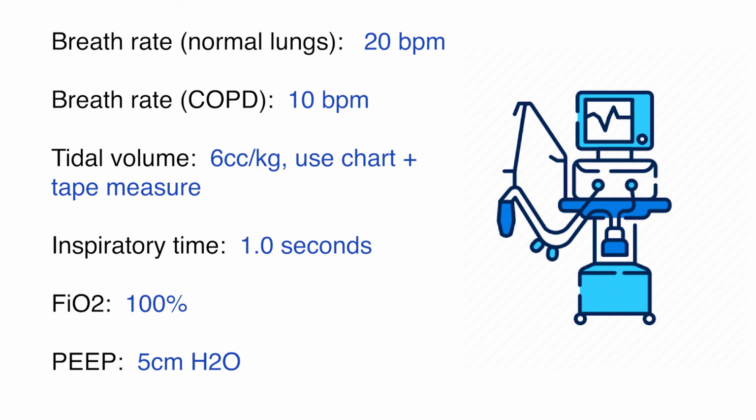Observe the patient's O2 saturation and end-tidal CO2 for a few minutes to confirm everything is working as expected. Also be sure to watch for hypotension with the onset of positive pressure ventilation. Once the patient is stable, you can exit the room.